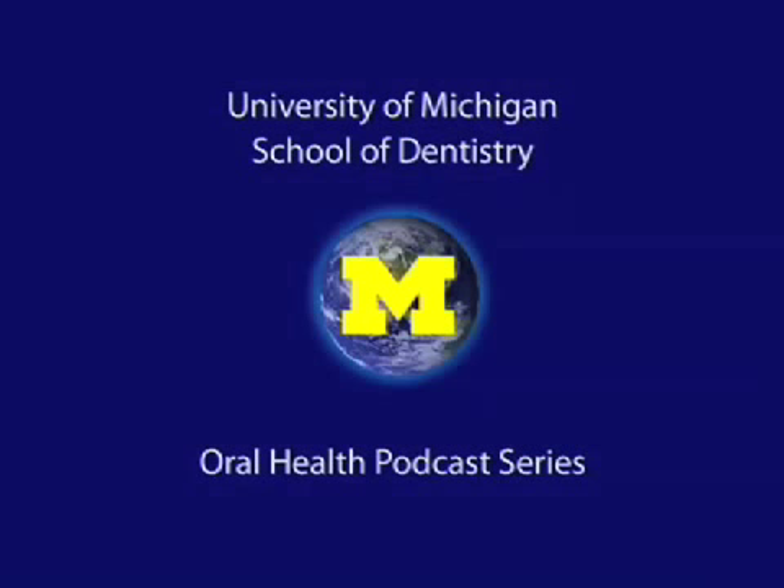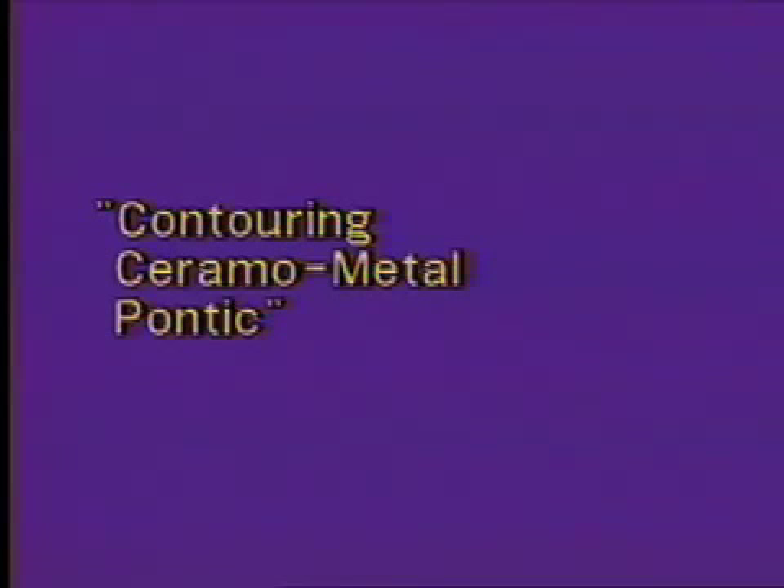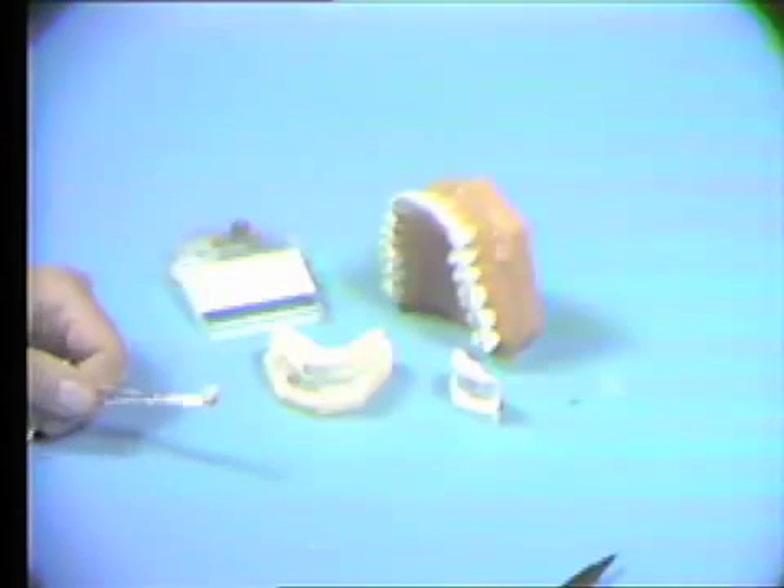Welcome to the University of Michigan Dentistry Podcast Series, promoting oral health care worldwide. In this sequence, we will be adjusting the pre-made ceramo-metallic pontic.